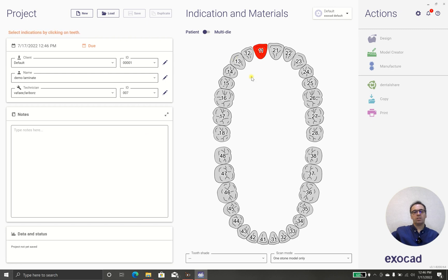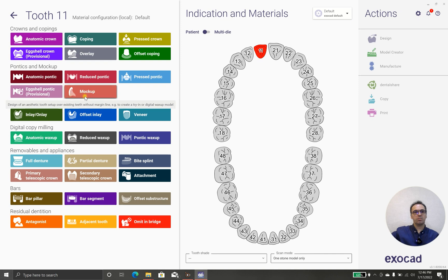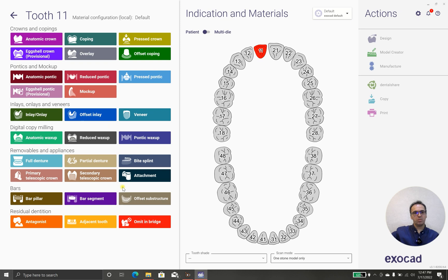And now we are going to have veneers. As you can see, the mock-up is going in the pontics and most of the things are unchanged, but let's go inside and check what's different inside.